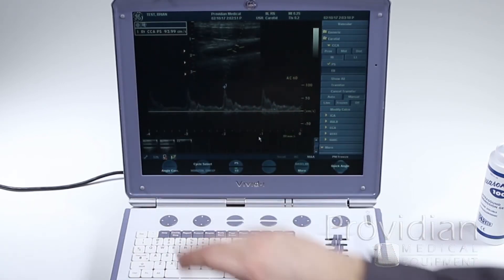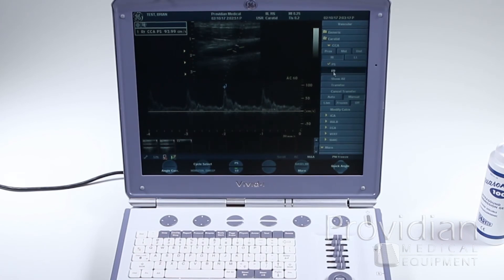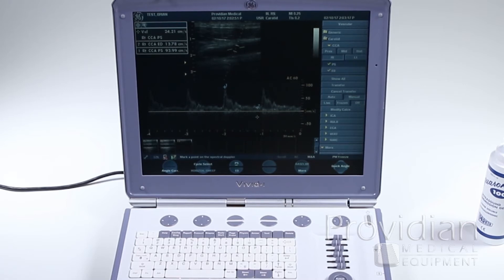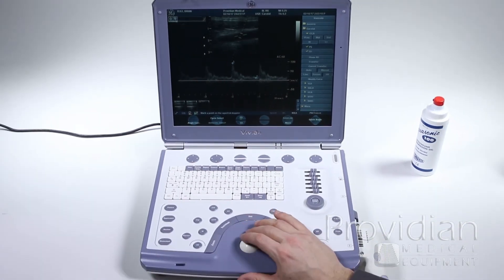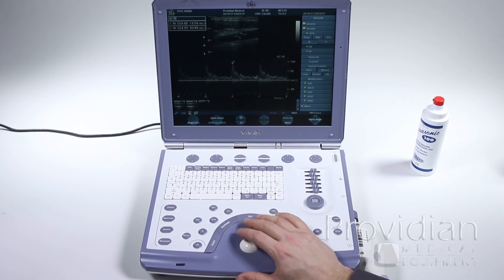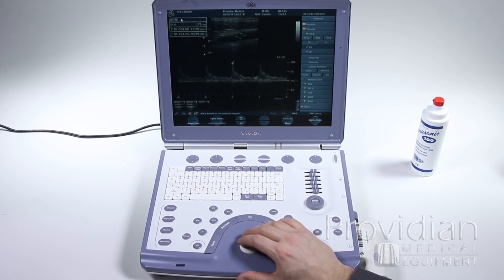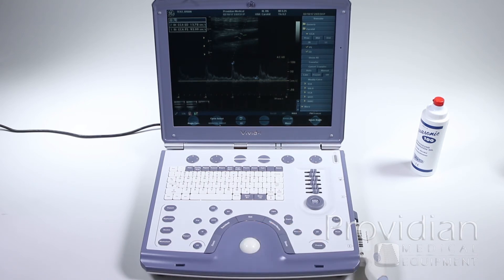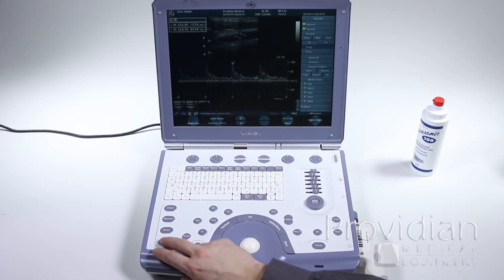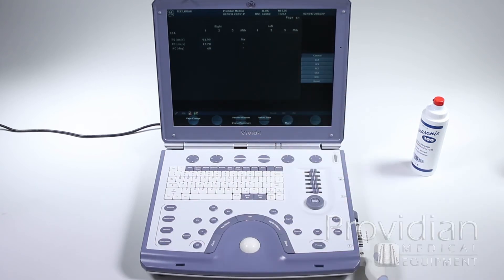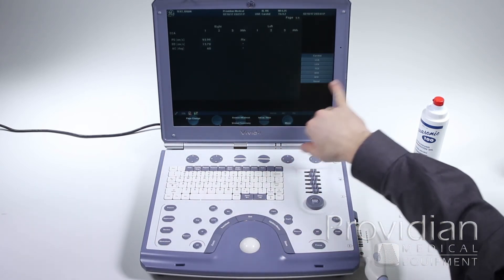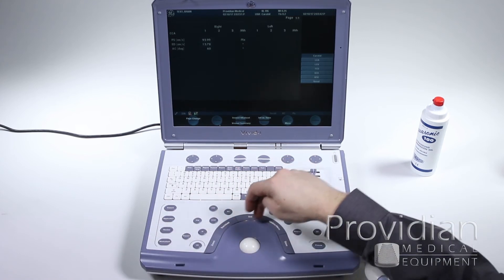Go ahead and choose end diastolic. Now you have the two points. You can move and hide the box, click set, and move the results box around the screen. Then you have your results there. If you unfreeze, it'll show up on the worksheet — right there showing my right CCA exactly how I assigned it.